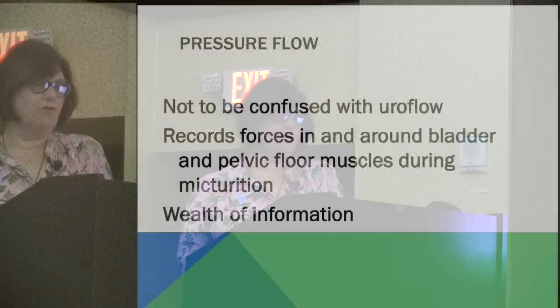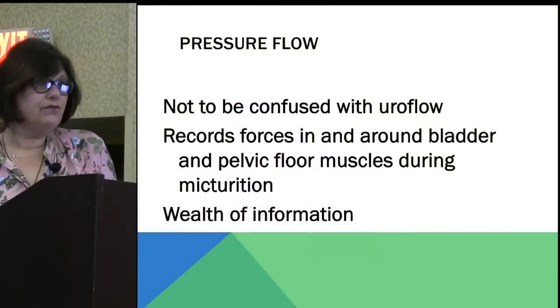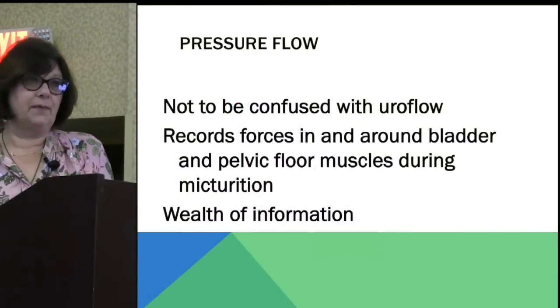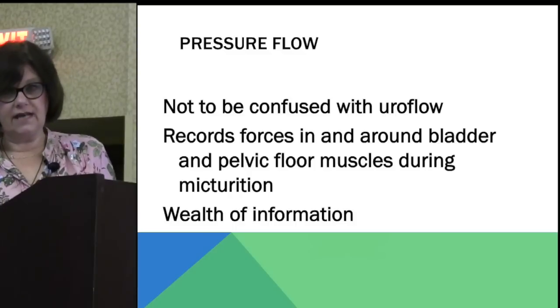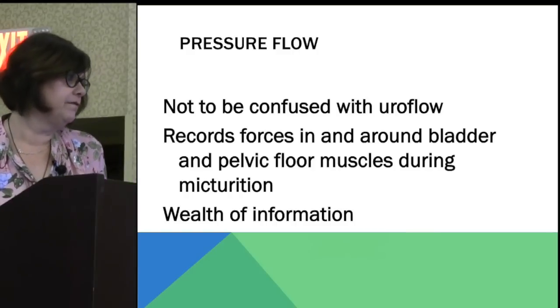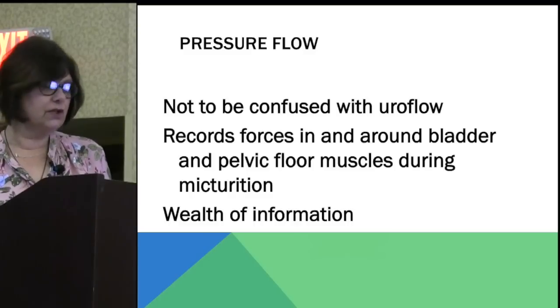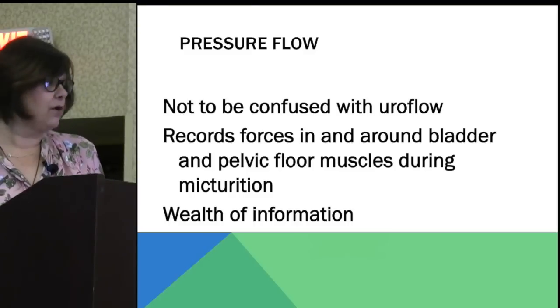All right, so the pressure flow. Some people do get the terminology pressure flow and uroflow confused with each other, and they are quite different. So uroflow is what we do at the beginning of the test. The patient comes in with a full bladder, they sit down, and we're trying to determine their flow pattern and whether they have a large post-void residual or not. Are they emptying their bladder well?